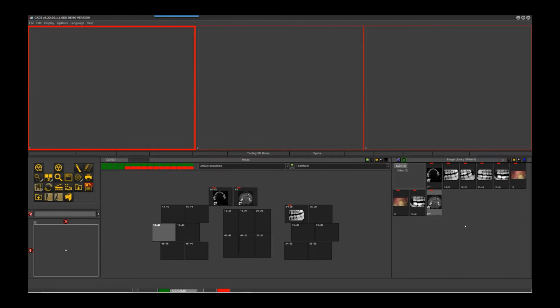Okay. All right. Well, I'm good at being a squeaky wheel. There you go. I mean, that's what it takes. It takes their users to start asking for it. I have mentioned it to their team, and they've taken note of it. But the more people out in the field start asking for it, the sooner they're going to do it.